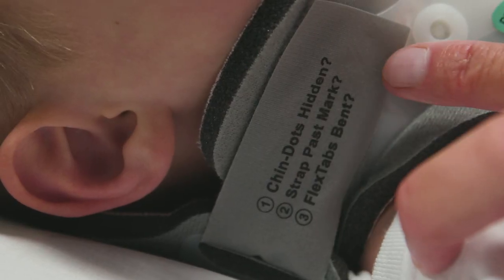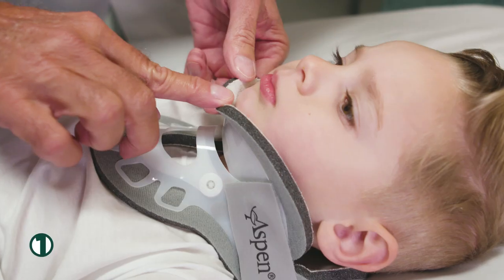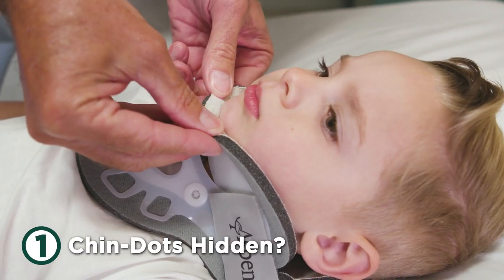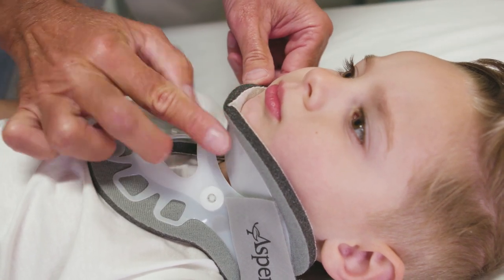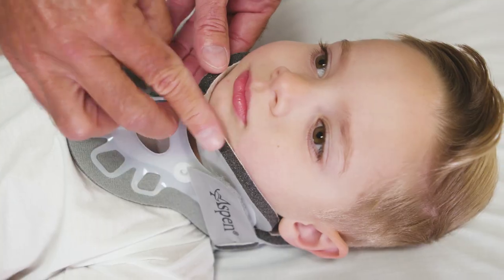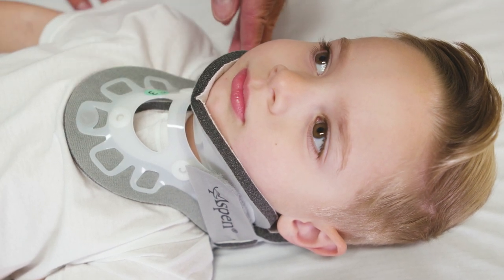Finally, check that the collar is properly fit using the three points printed on the loop strap as a guideline. First, are the chin dots hidden? The chin piece plastic should be flush with the end of the chin, hiding the chin dots indicator on the chin pad. If these dots are not hidden beneath the patient's chin, the collar needs to be re-tightened.